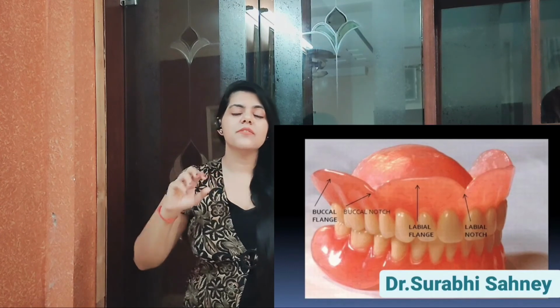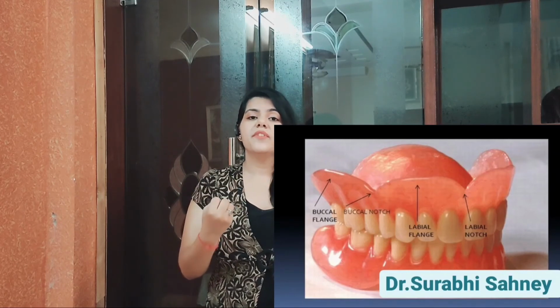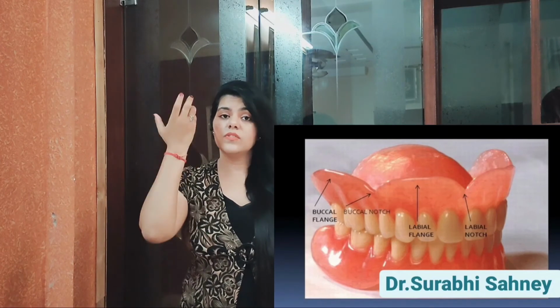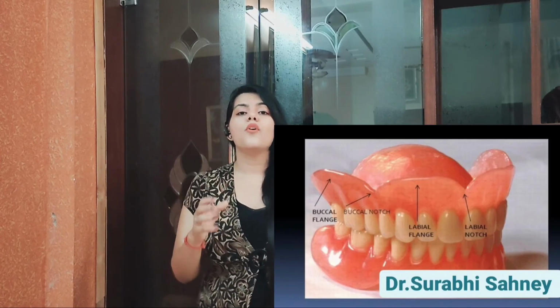आप जब complete denture fabricate कर रहे हैं तो आपको buccal flange पे relief देना बहुत ज़रूरी है. Otherwise muscles relief नहीं होगी तो definitely necrosis हो सकता है, pressure पड़ सकता है, denture stability पे effect आ सकता है, हो सकता है वो एकदम से गिर जाए. ठीक है, तो that's why buccal flange पे support देना बहुत बहुत ज़रूरी हो.